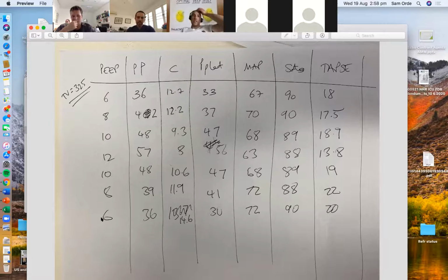I mean, to be honest, I'd be quite hesitant to perform a PEEP titration in a patient with underlying fibrotic lung disease unless I was quite unhappy with the ventilation. And that first line I wouldn't be completely unhappy with, to be honest. Yeah, absolutely. This was one of the arguments the fellow said to me as well, and that's why I wasn't going high with the PEEP. But the numbers did get better. The numbers did get better. He had pretty bad atelectasis as well in one of the areas.